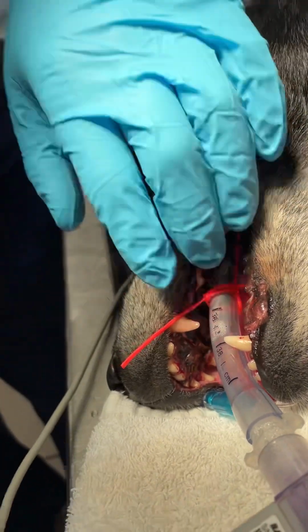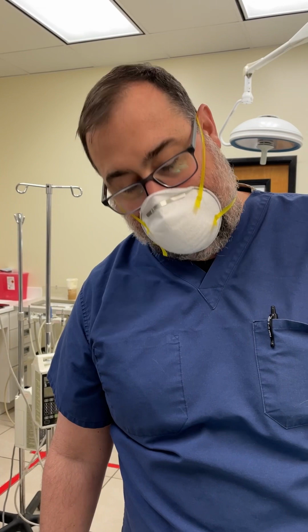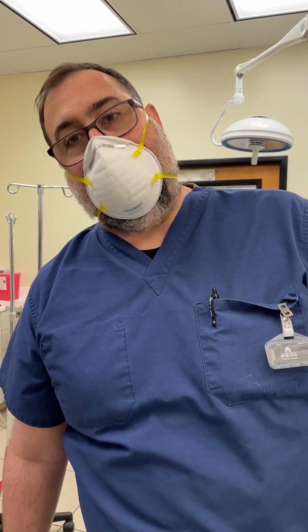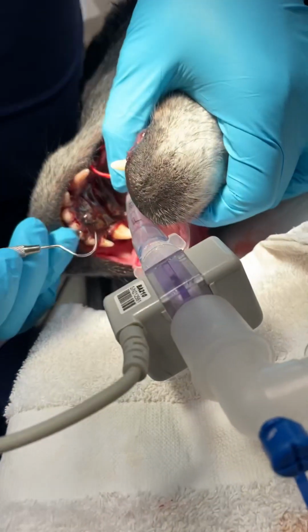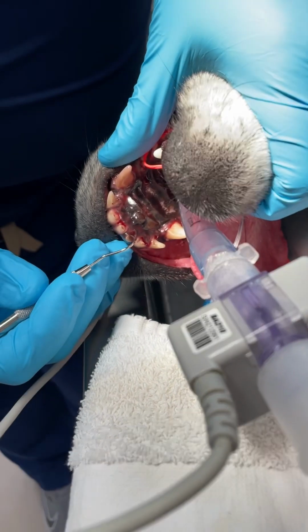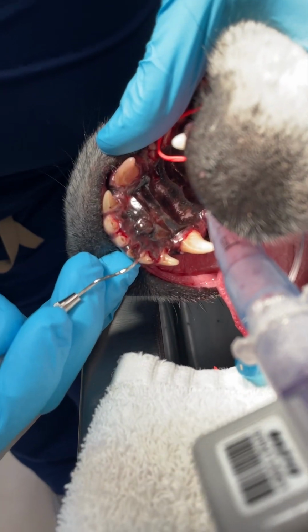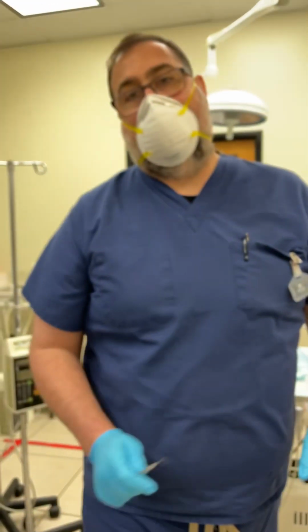The other thing though is when you do these dentals and you're able to probe these teeth under anesthesia and take x-rays, you're able to find a lot of things you don't see on just a regular exam or you wouldn't find on a non-anesthetic dental. So she actually is a ball chewer. She's been chewing balls her whole life, and she's got a broken tooth here or a worn down tooth, but it's got, again, pulp exposure. So just like a fracture, that tooth is also going to be infected and dead and need to come out.